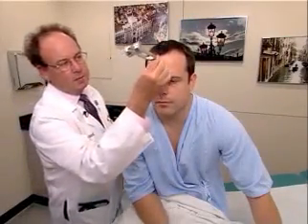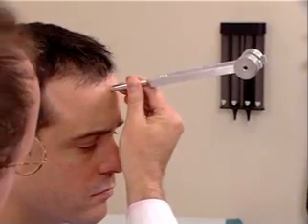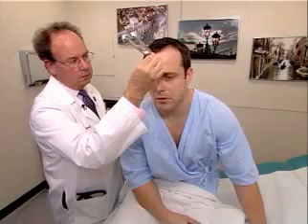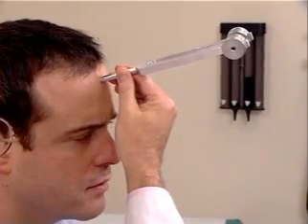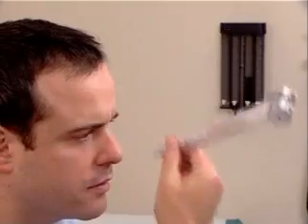The second test is the Weber test. One strikes the tuning fork and places it midline on the patient's forehead, and the patient is asked, do you hear or feel anything? Yes. Okay. Tell me what you hear or feel. Vibration. Okay. Where do you feel it? Both sides of my head. Does it feel equal, or is it in one place louder than another? No, it feels equal. We call that no lateralization, and that is the normal Weber test.